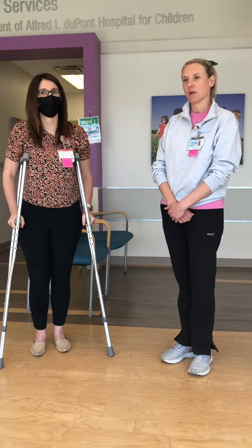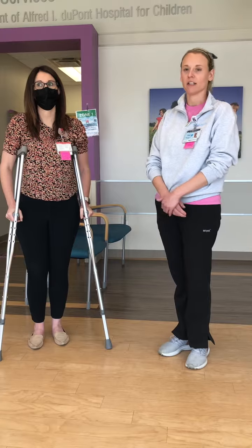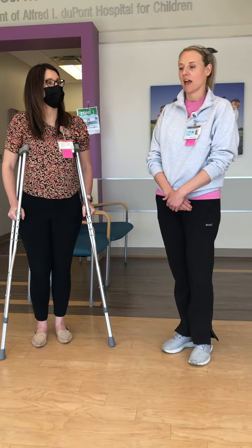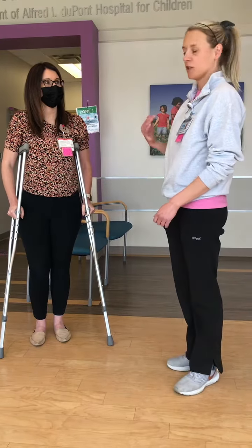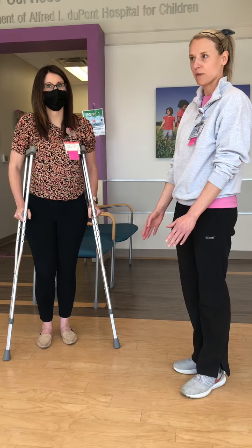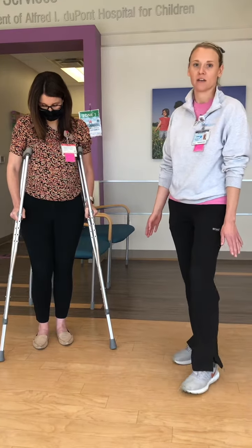You'll want to start by getting the patient's height, which you can either find in their chart or ask them directly. You'll want to get the appropriate crutch size and then have the patient stand facing you with the crutches at least two inches out from the toes and six inches out from the side of their feet.